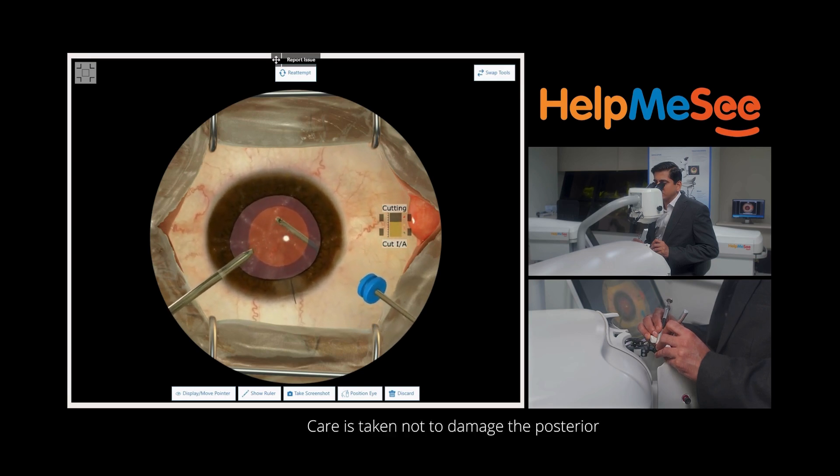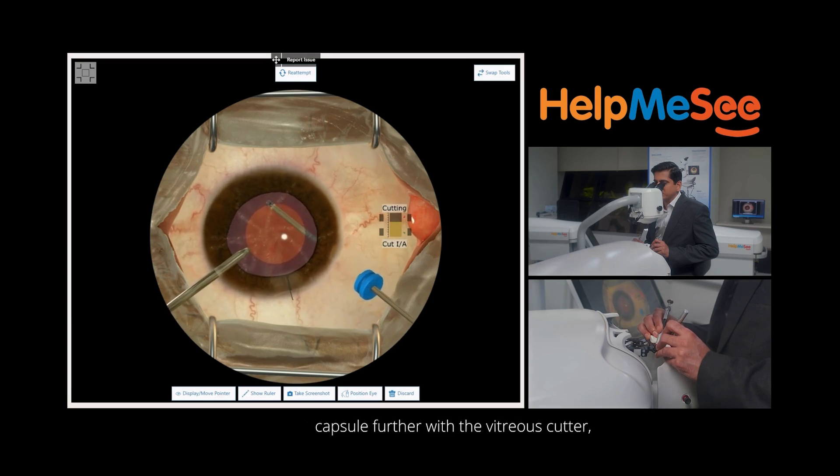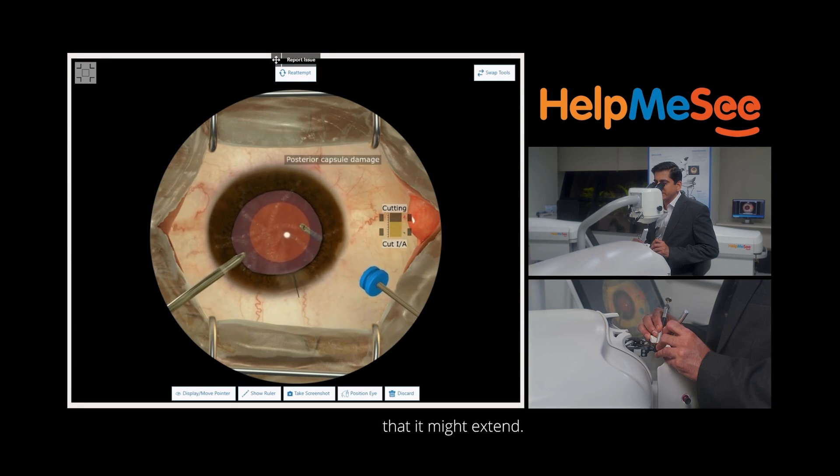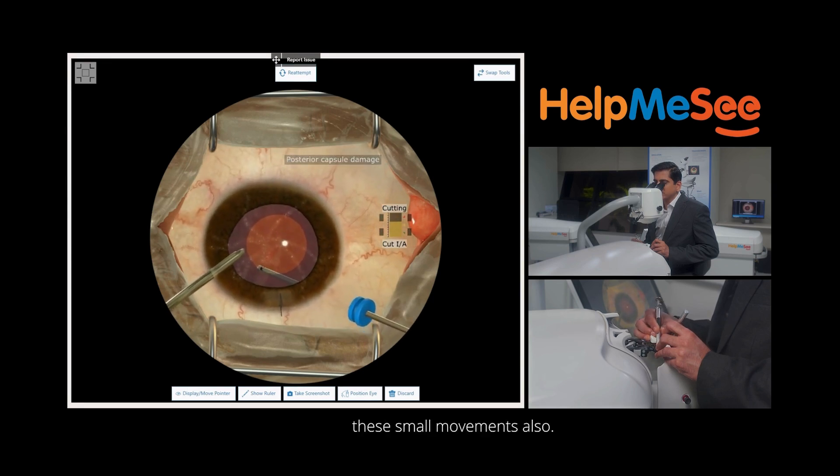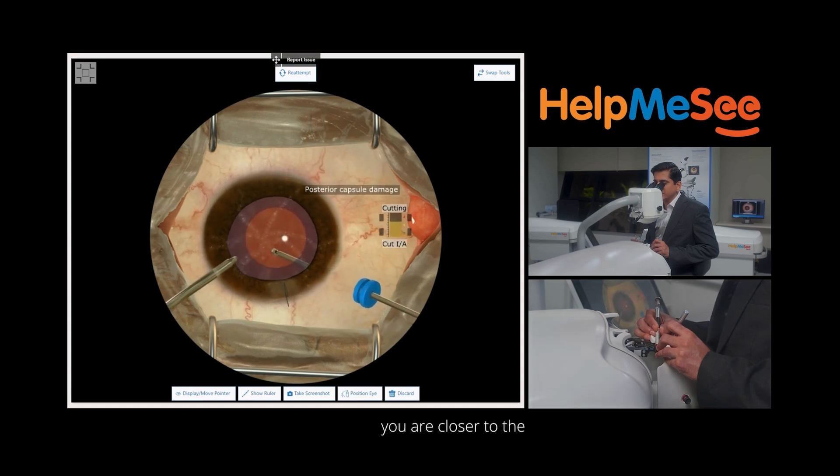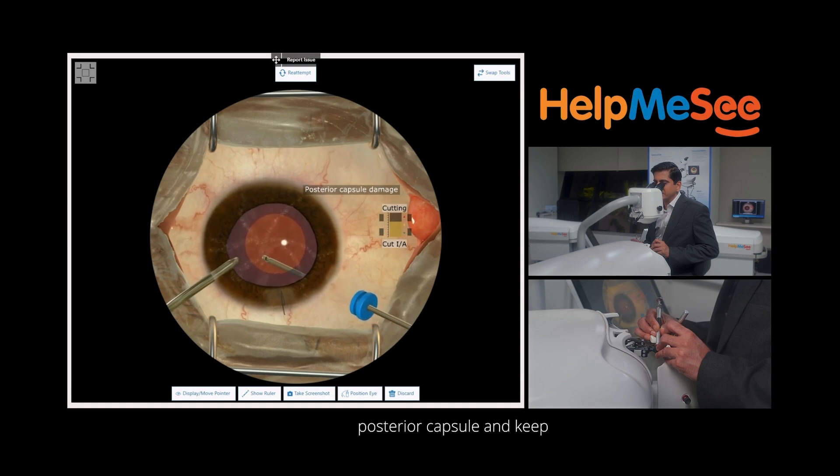Care is taken not to damage the posterior capsule further with the vitreous cutter, but there are chances that it might extend. The simulator picks up these small movements also. It will indicate with alerts saying that you are closer to the posterior capsule and keep away.